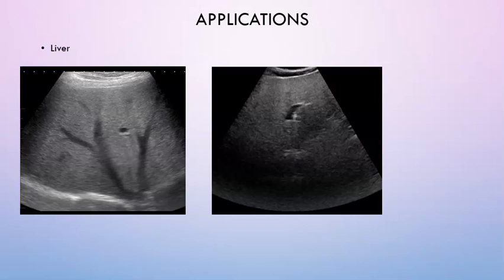So now here we have two images of what are potentially fatty livers, and how can you tell if they're fatty livers? Well, a fatty liver is going to be harder than a normal liver, but if you look at these, which is the fatty liver? Well, obviously this one, you have poor penetration due to the amount of increased attenuation due to the fatty liver. But it turns out that with elastography we can tell that both of these are fatty livers.